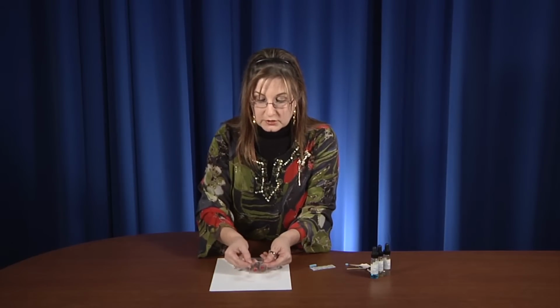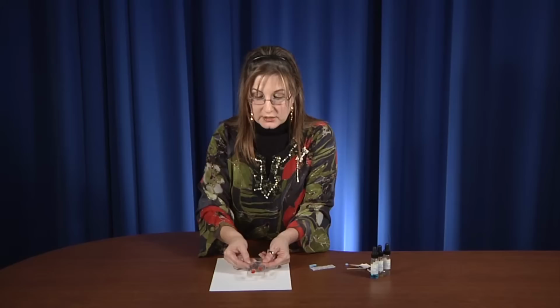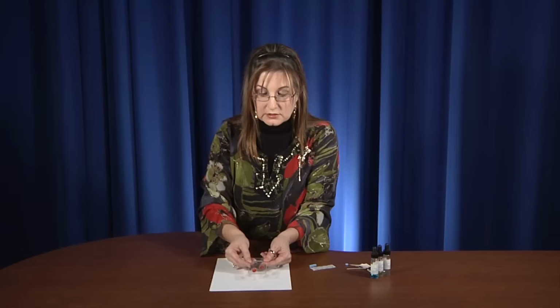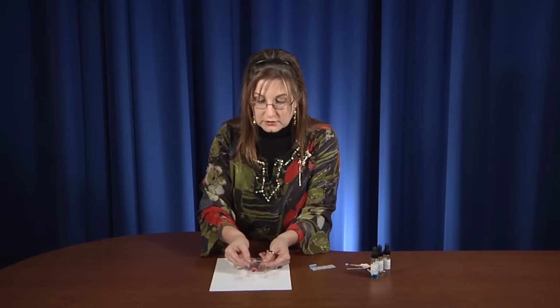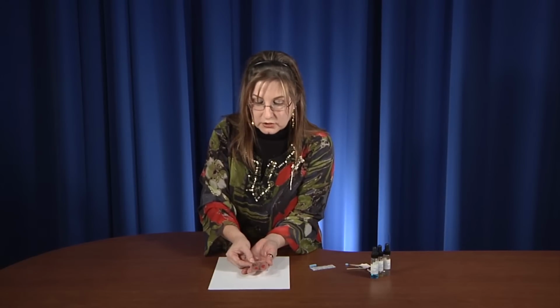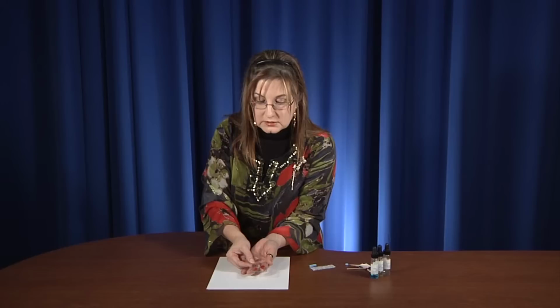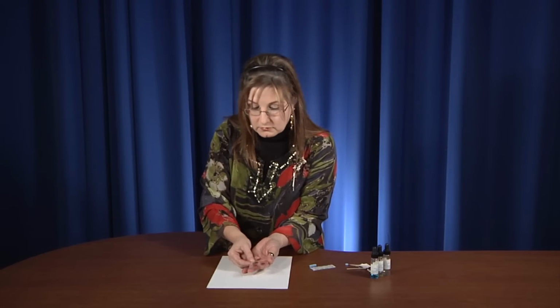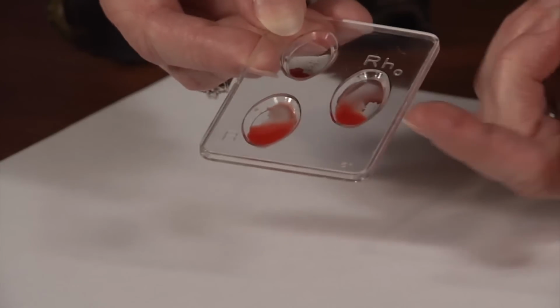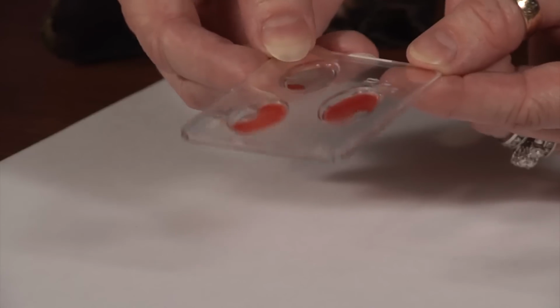Now, the RH typically takes a little bit longer for the reaction to occur, and when you start to see the reaction, the agglutination is much less noticeable. So I'm going to rock this gently for a few seconds because I know that I should have agglutination in that well because I know my blood type. And sometimes if you apply just a little bit of heat to it, it speeds the reaction as well. So let's give it just a second and see what happens. You know, it's sort of like kids. When you want it to perform, it doesn't. And you can see a bit of agglutination starting to occur as the blood is running down the wells.